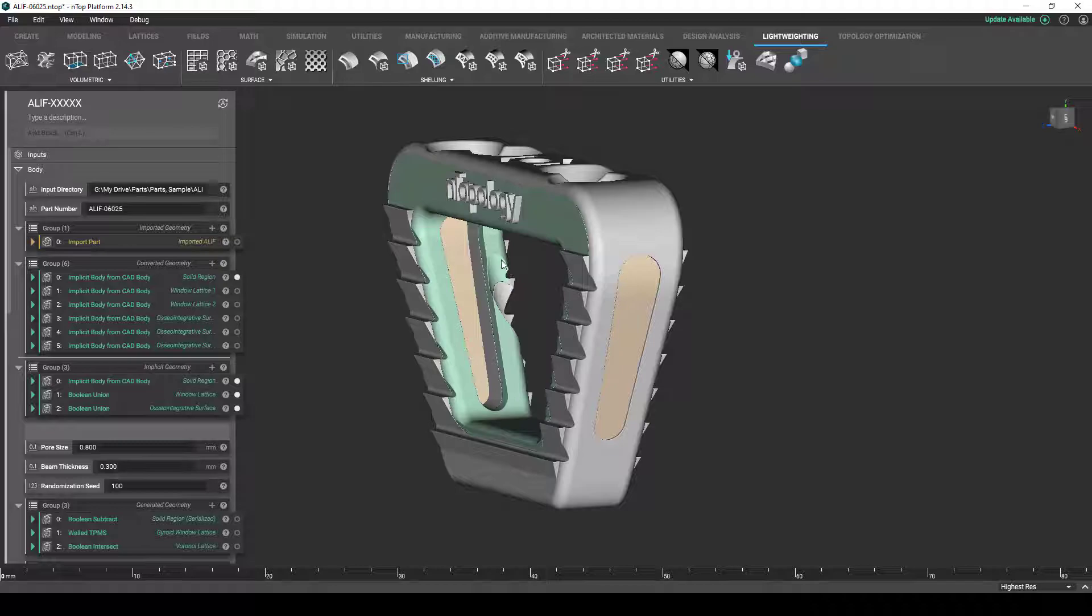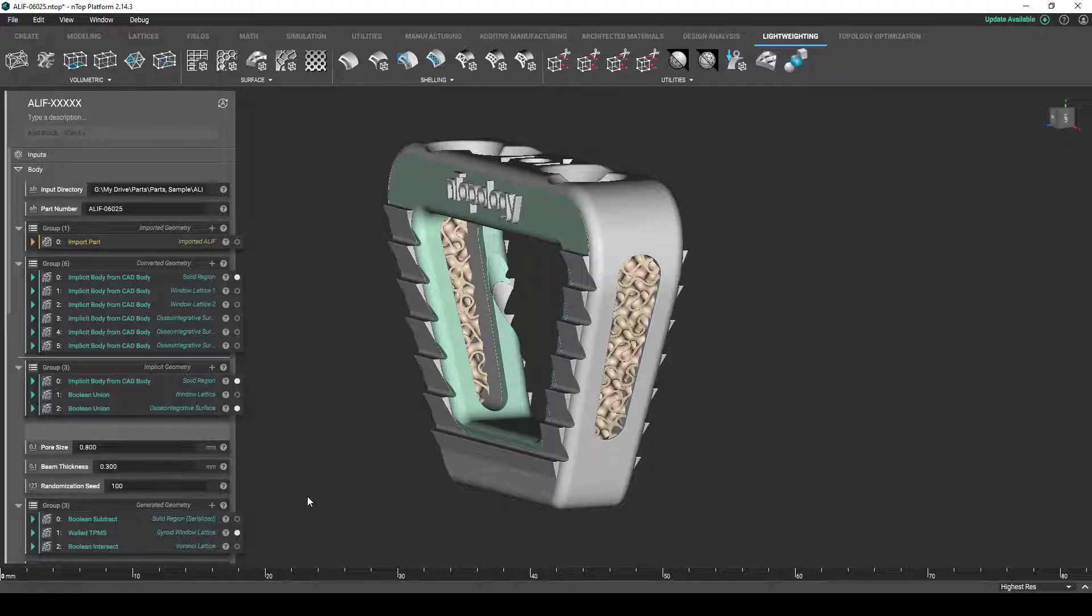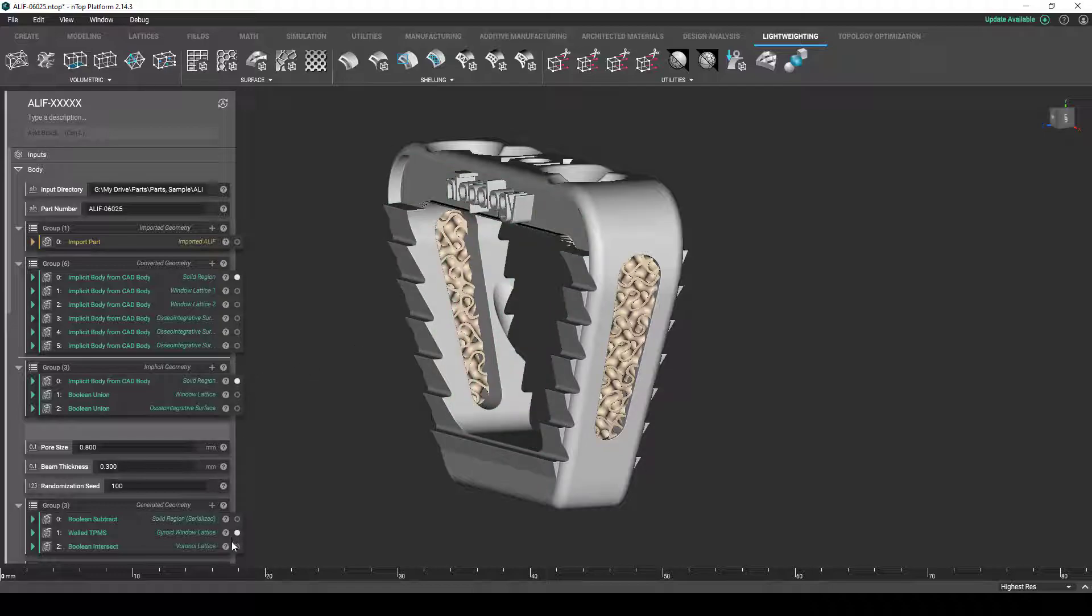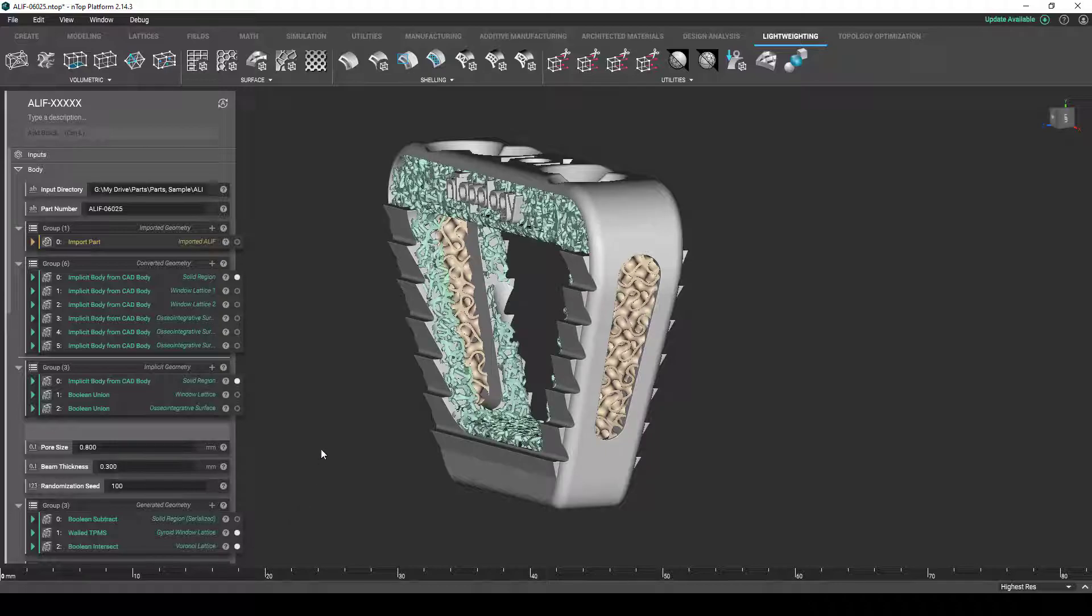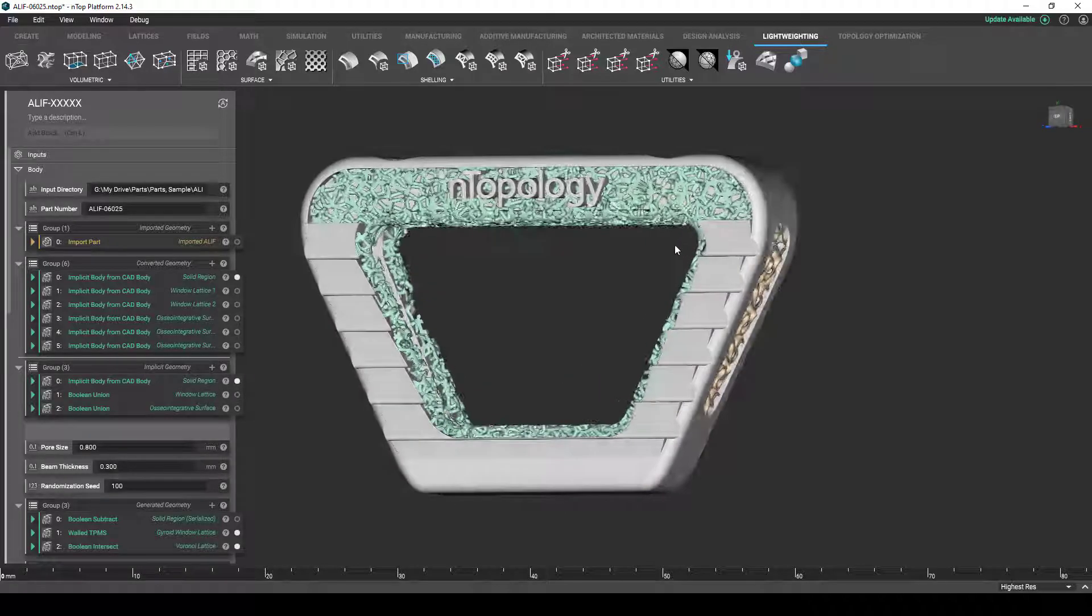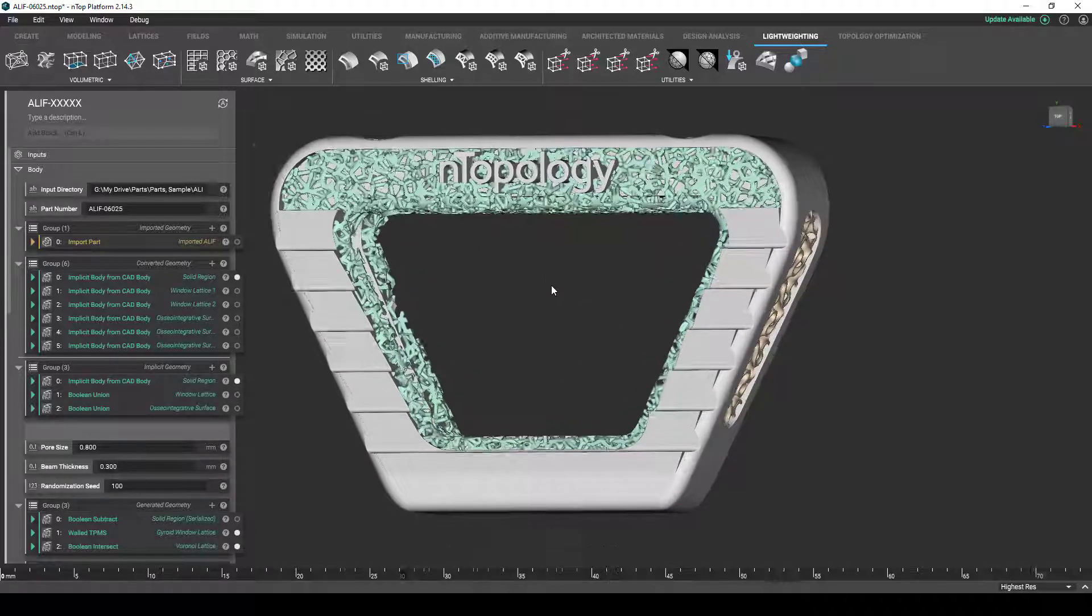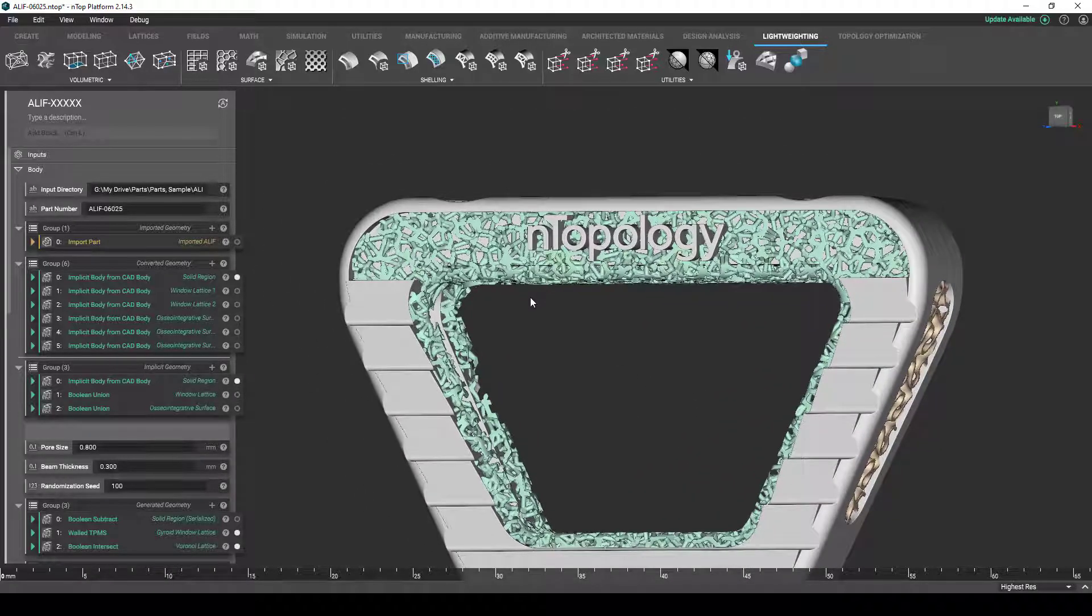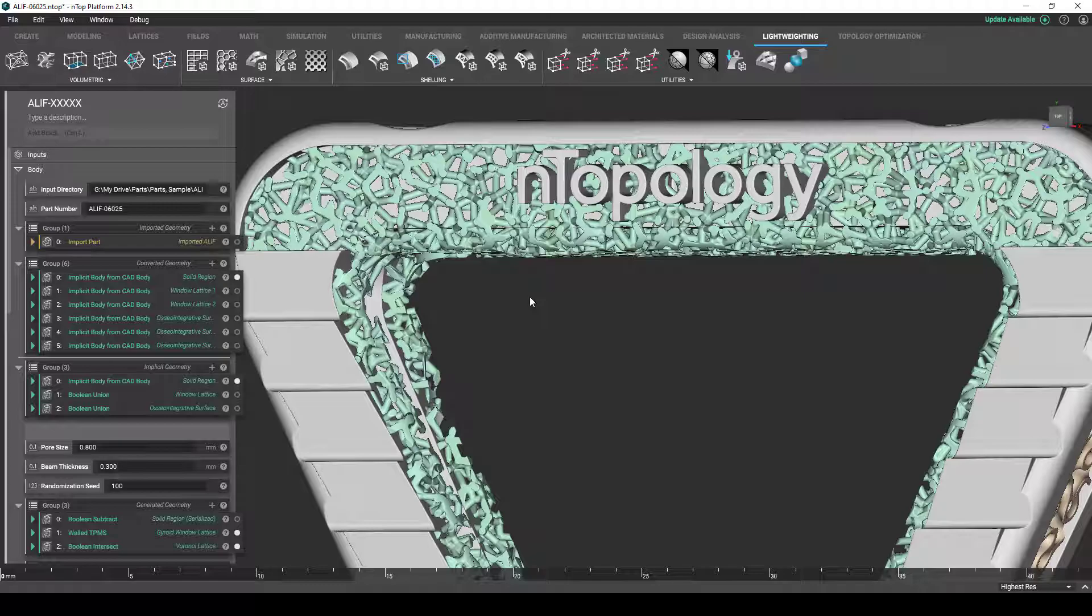So, for the window lattice, we've chosen this gyroid lattice here and filled both windows with this structure. And for the osseo-integrative lattice, we've chosen this randomized Voronoi lattice structure. And it's a randomized distribution of lattice beams to create a structure that closely mimics the trabecular structure that exists inside actual human bone.